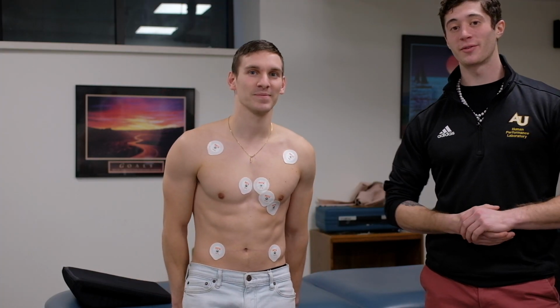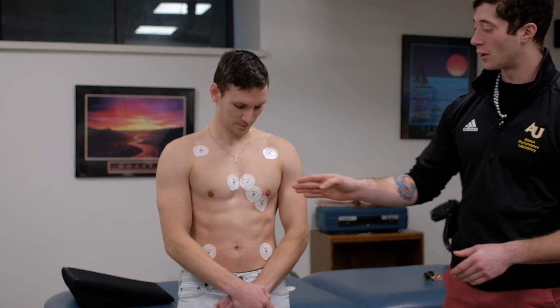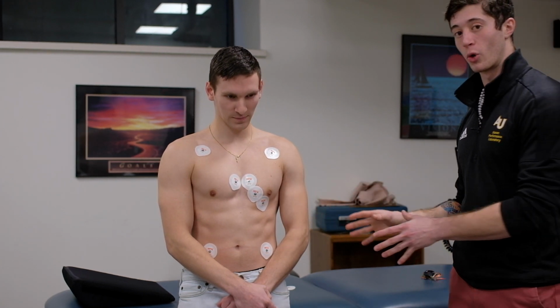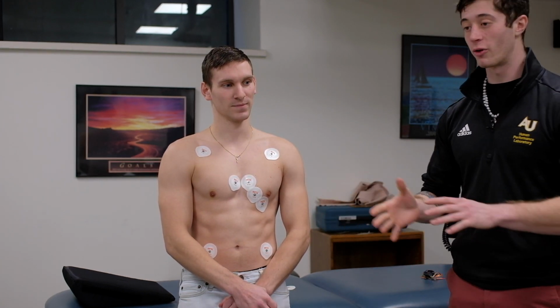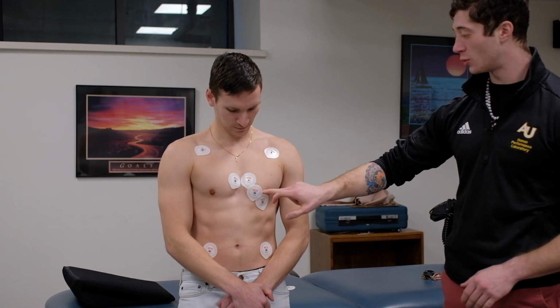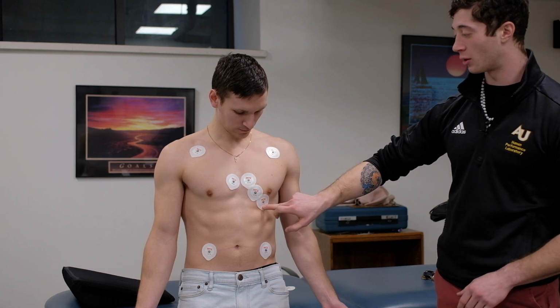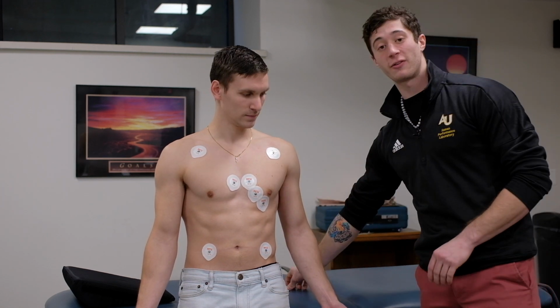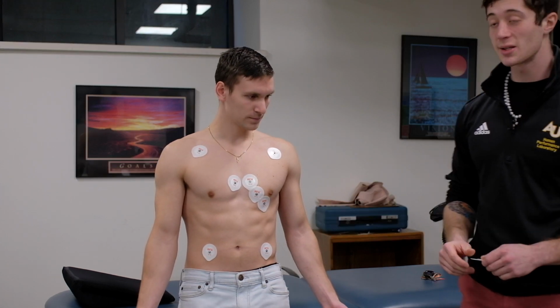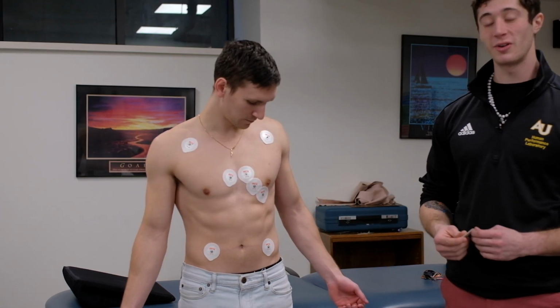Alright, we had a couple of technical difficulties with the camera not recording certain clips, so we're going to continue here. As I was saying, the V-leads perform the role of giving us a picture of the heart from every angle. So, we've gone through V1, V2, V3, and V4. V4 is on the mid-clavicular line, and it is in the fifth intercostal space. The next leads that we have to put on follow the level of V4. They're going to be V5 and V6.